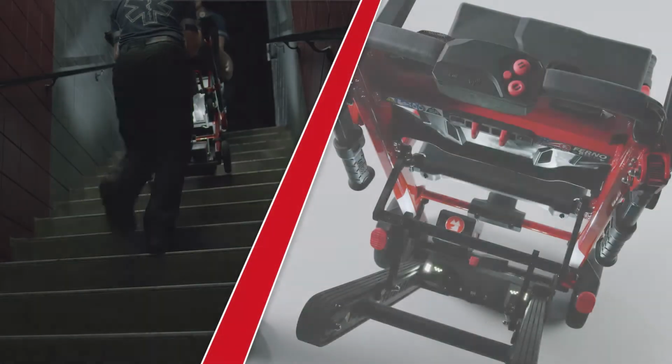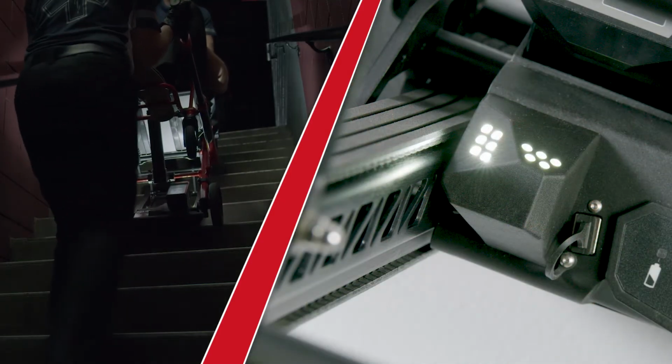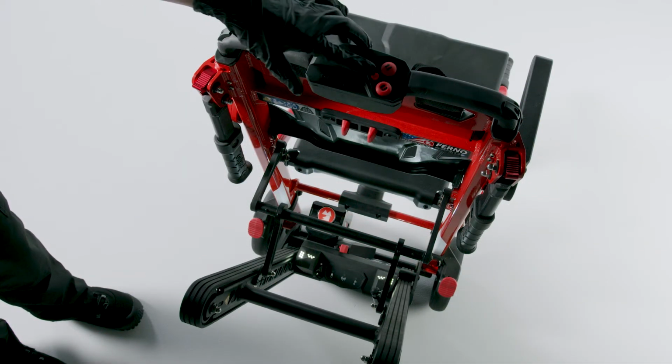The scene lights provide reflective illumination around the chair using built-in LED lights. Press the small red button on the controller to cycle the lights between low, high, and off.